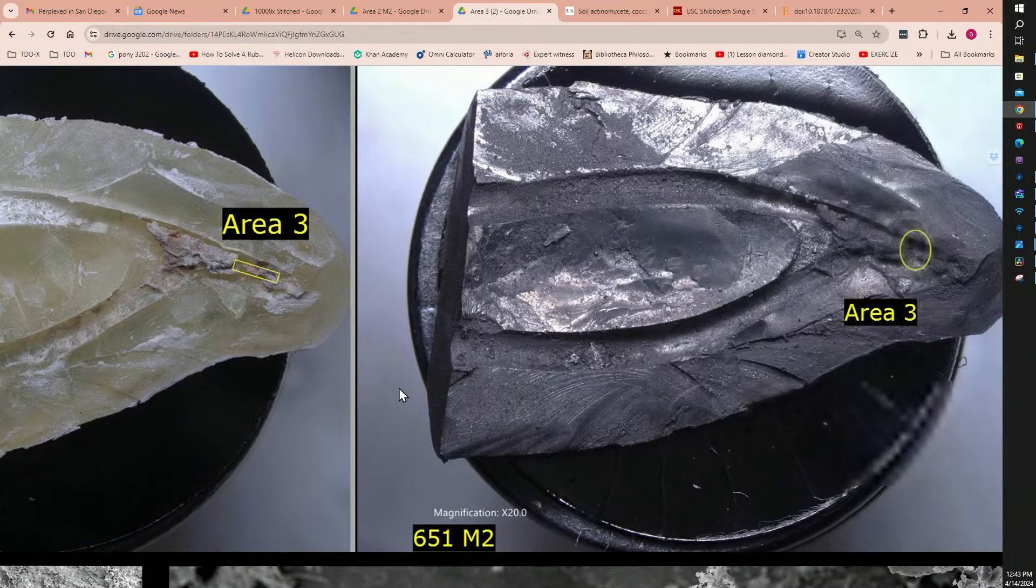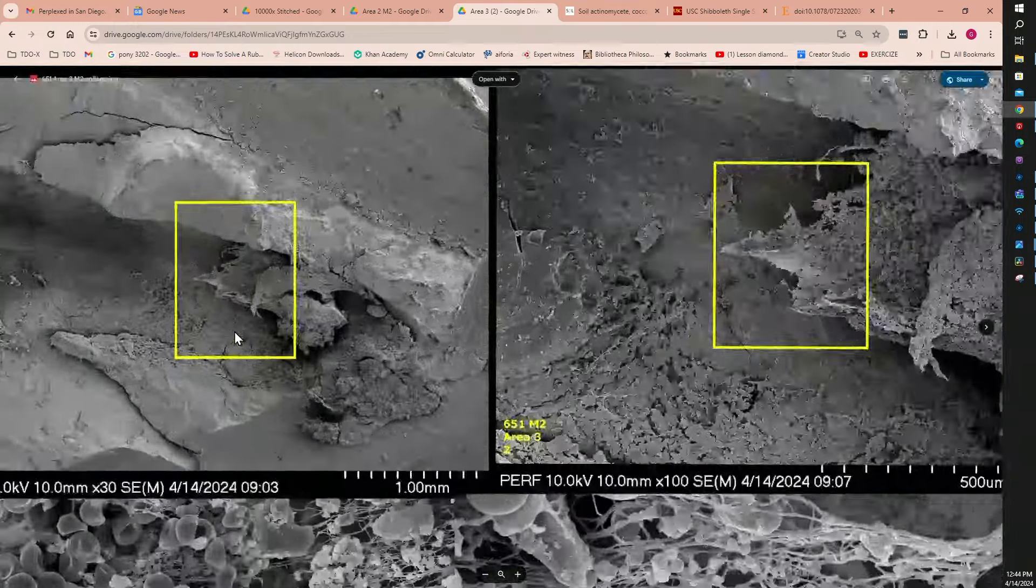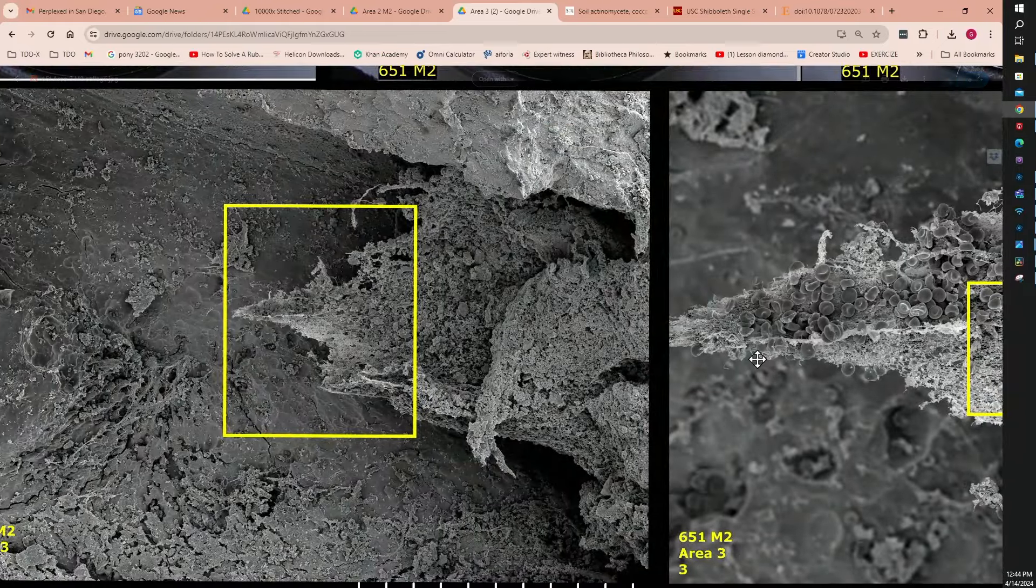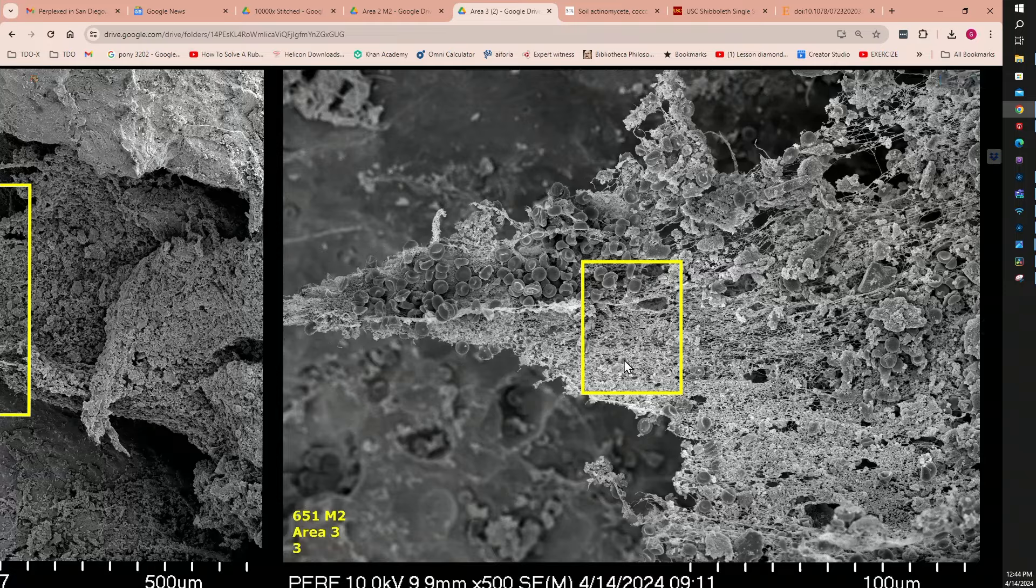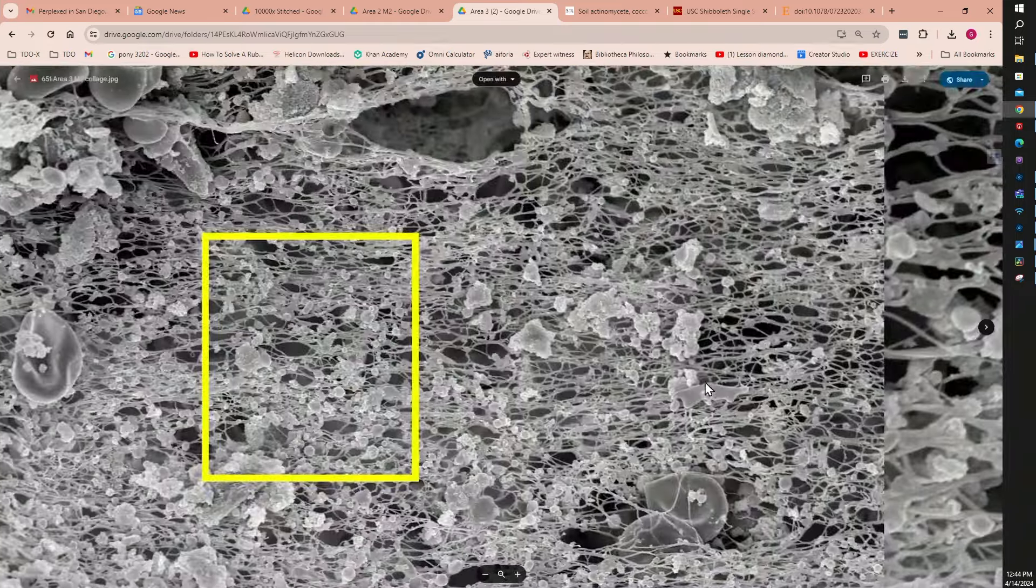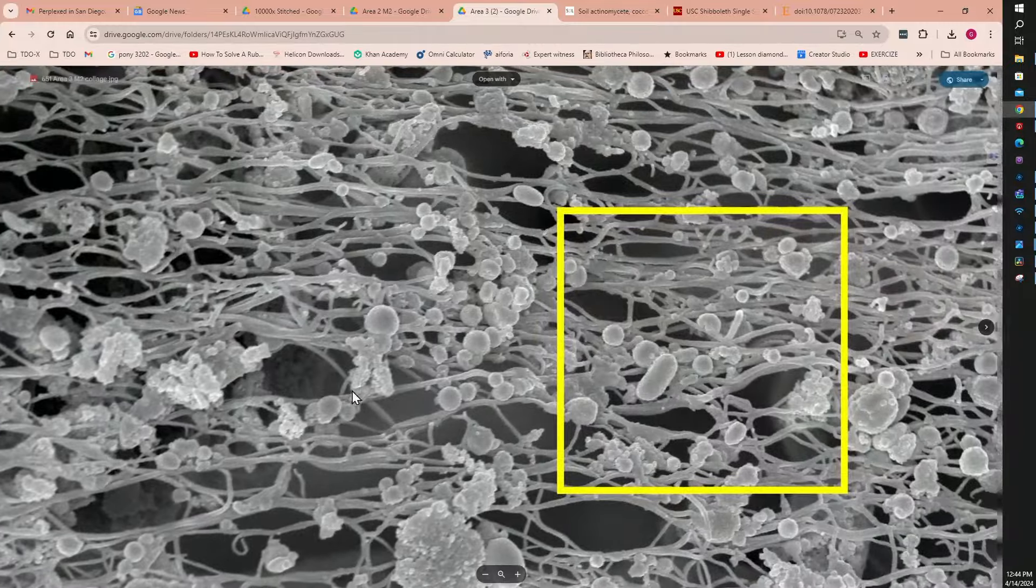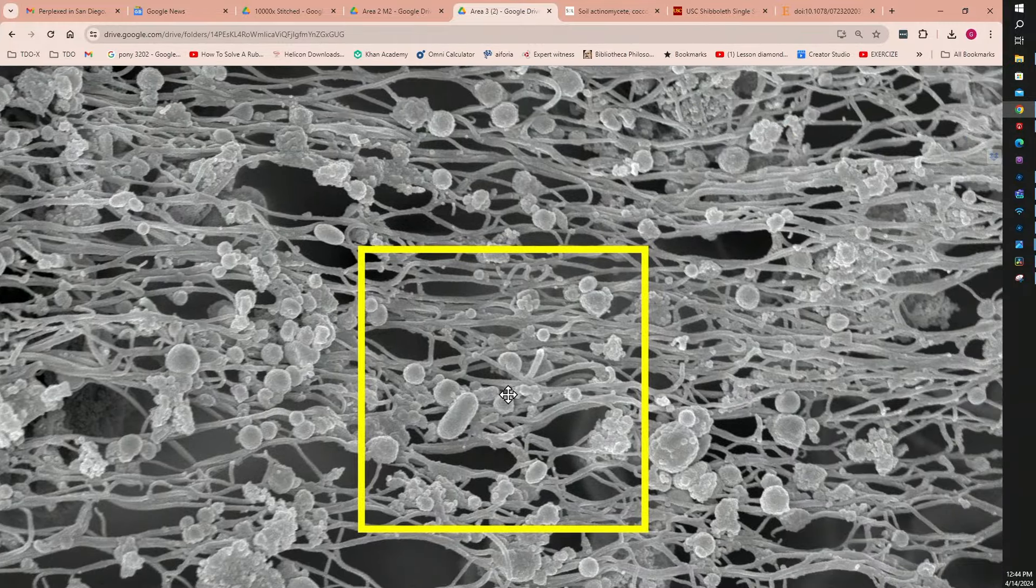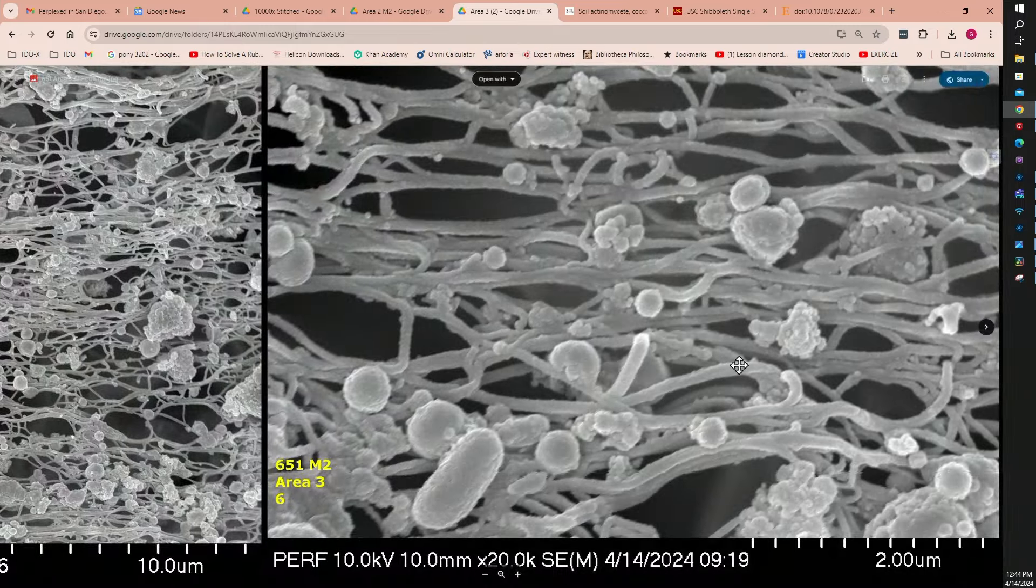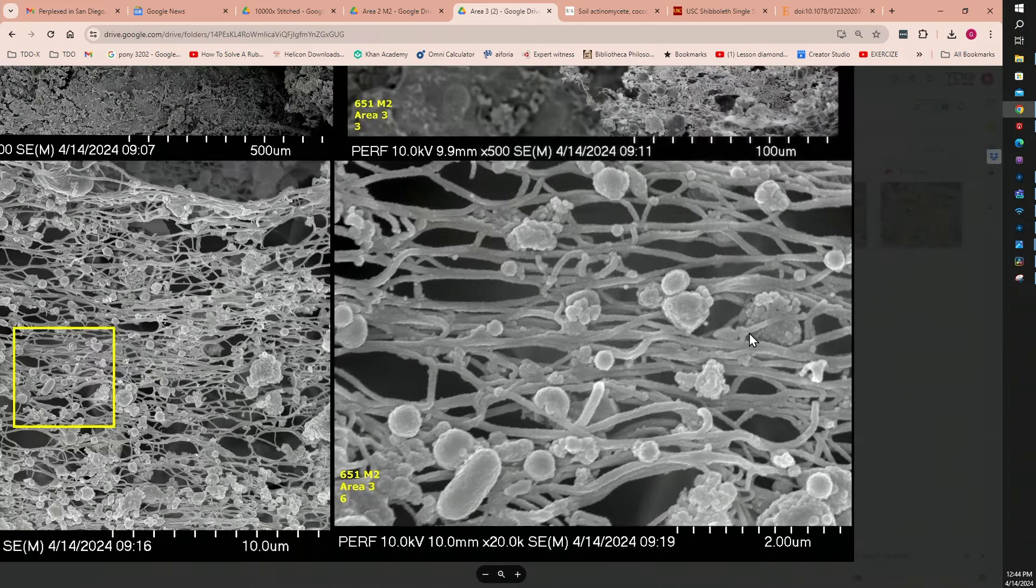And maybe you'll see things that I don't see in this particular area on the mesial root when you go into the soft tissue. You can see what I thought initially were maybe yeast, but these are too small to be yeast. And you have kind of a standard actinomycetes type of impregnation of that tissue. So overall, a very interesting case. I'd be interested in your comments.